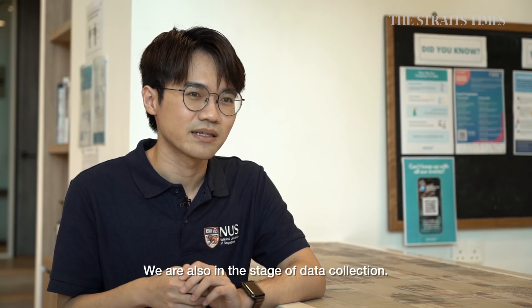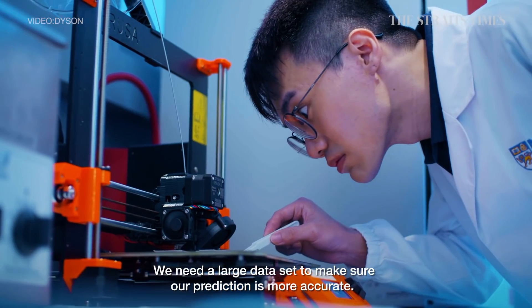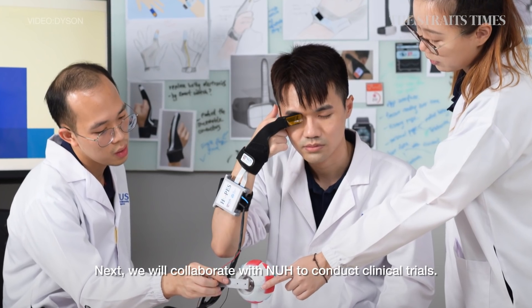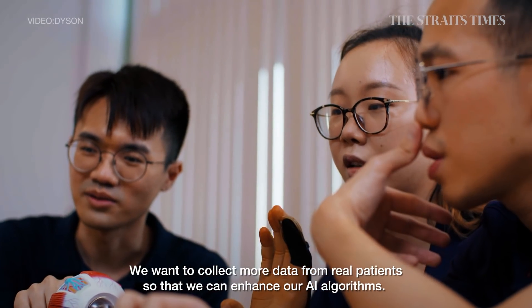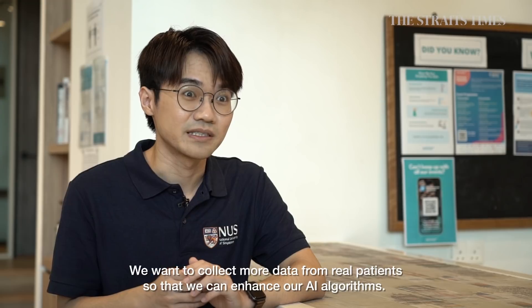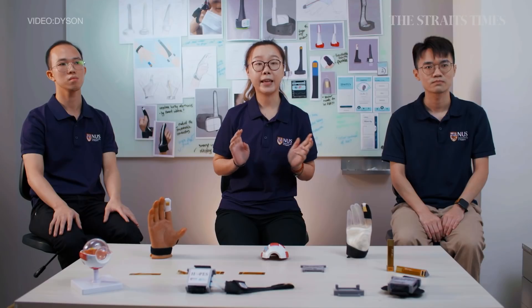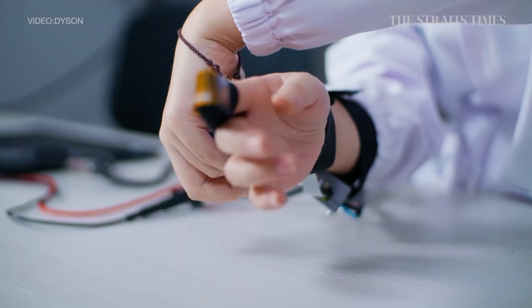We are currently in the state of data collection. We need a large dataset to make sure our predictions are more accurate. The next step is to collaborate with NUH to conduct clinical trials, to collect more data from real glaucoma patient volunteers so that we can enhance our AI algorithm. HOPS is the international winner of this year's James Dyson Award — the first by a Singapore team.